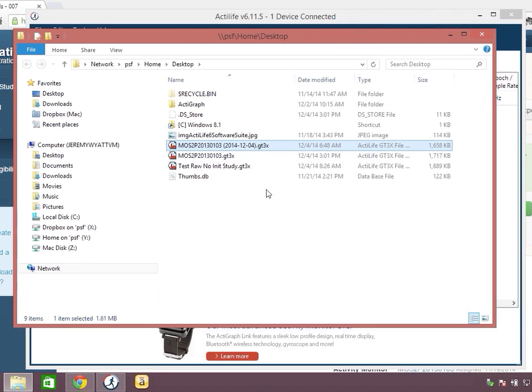And so some of you are thinking, well, why do I have to get the device? Well, pretty soon that will not be necessary. We're working towards making these raw data uploads available at each site level. We're looking at early to mid-January to have that option ready. But we wanted to give you the option to preview this before the end of the year and give you the option to actually use this if it sounds beneficial.